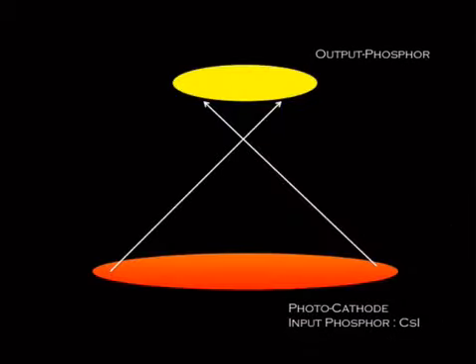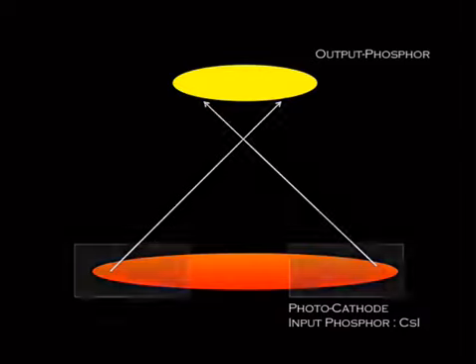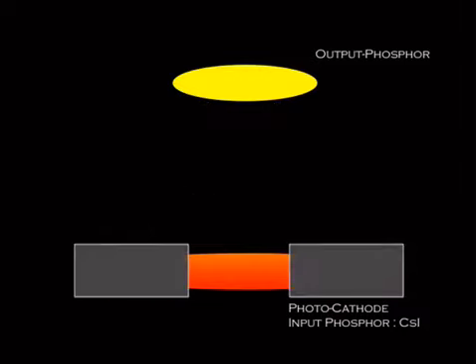So what does that mean? Basically, it means that you had a large photocathode surface originally, and you then concentrate the electrons on a smaller output phosphor. So you've got an increase in the number of electrons per unit area, and therefore the energy per unit area. So the number one take-home message here is, what are you doing when you're actually magging something? You are minifying it less. So maybe something like this, where you're not minifying it as much.